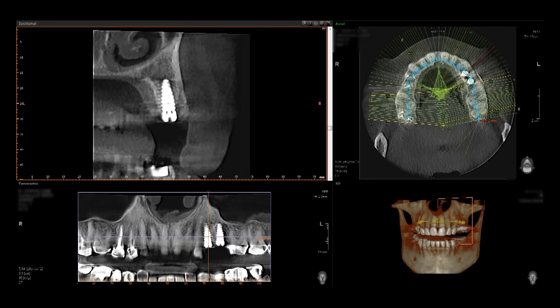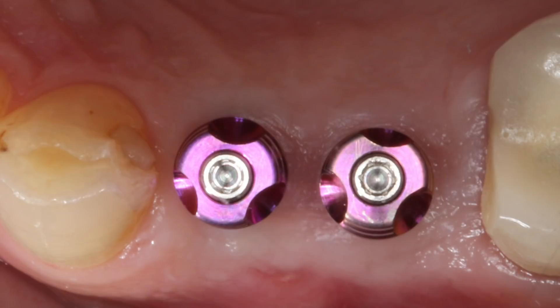The post-operative CBCT scan performed using the Pax Eye 3D Green Imaging System from VATEC America indicated that the two implants were optimally positioned. The sutures were removed after approximately seven days and the implant sites were allowed to heal for another four months. The patient then presented for final impressions. The transfer copings engaged the inside of the implants and a radiograph was taken to make sure the metal-to-metal components seated properly. Note that there was an excellent band of attached gingiva on the facial aspect of the implants and the bone contour appeared to be proper.